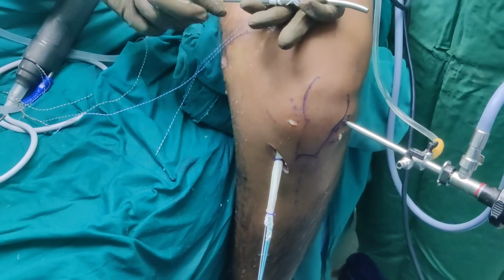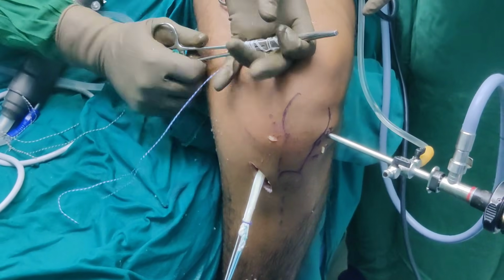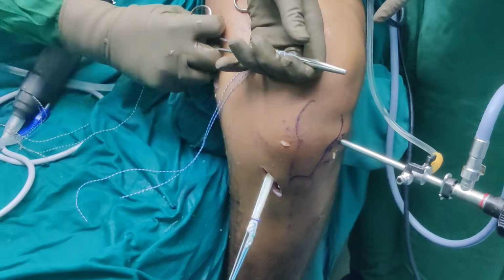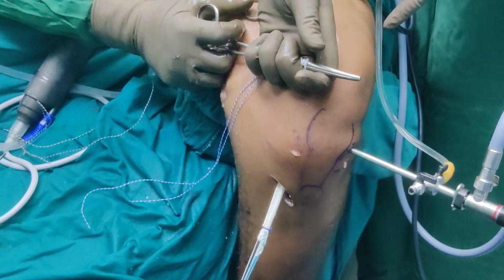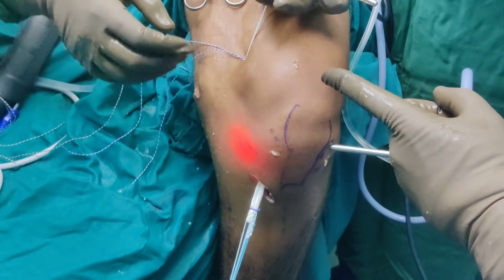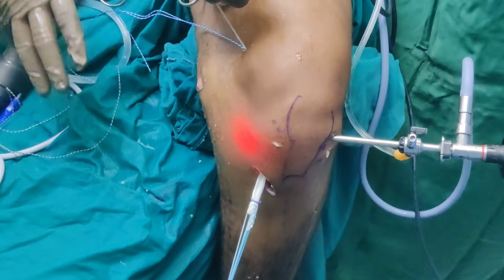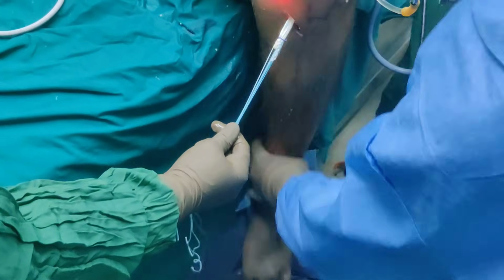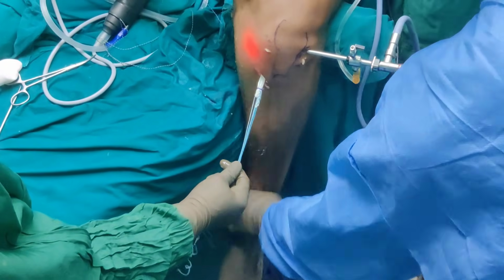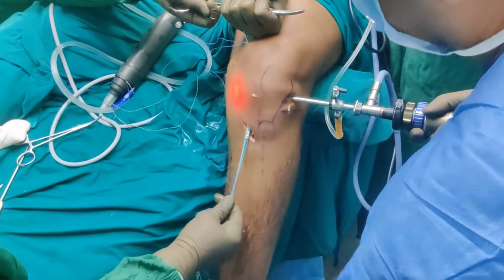That's it. Now this is where you need a lot of patience. So keep going, keep going, keep going. So there was a slight struggle in the graft going in. So if you have that, then just keep the tension on this side and cycle a few times and the graft will sink in automatically. So this is the trick. So just keep cycling and then the graft will continue to sink in. Can you see it? It's just going in slowly.